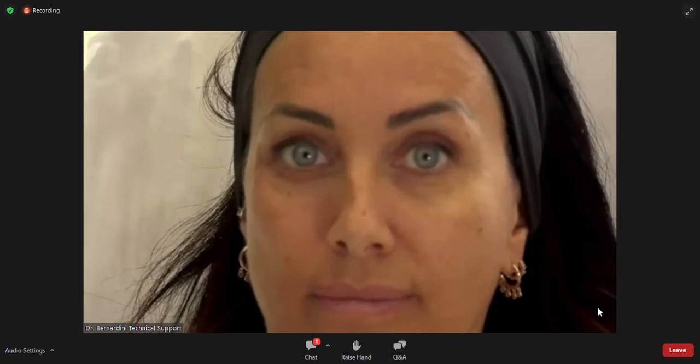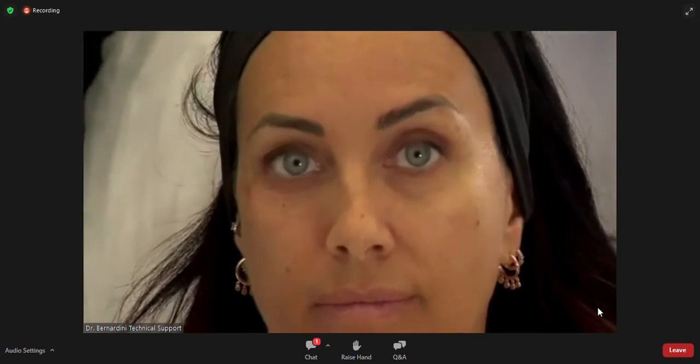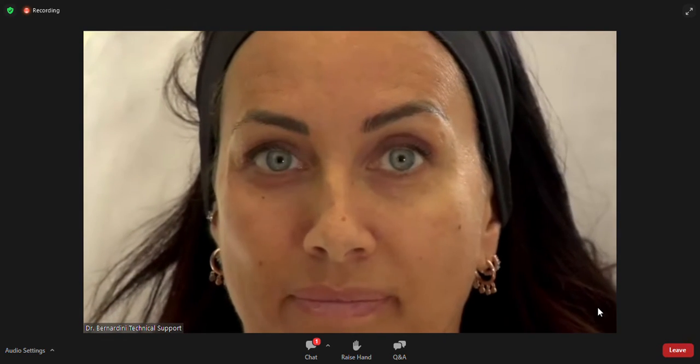I don't know, guys, I have a difficulty in seeing the screen. Okay, the light is not nice. Okay, thank you. So, this is the treated side. If I have to point it out, that means that it's not clearly visible.